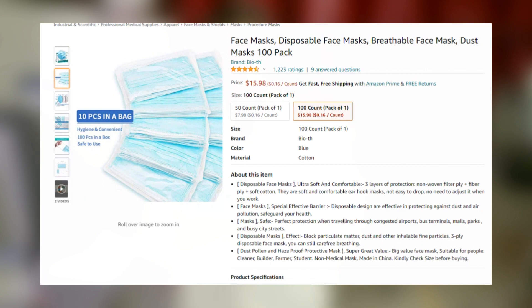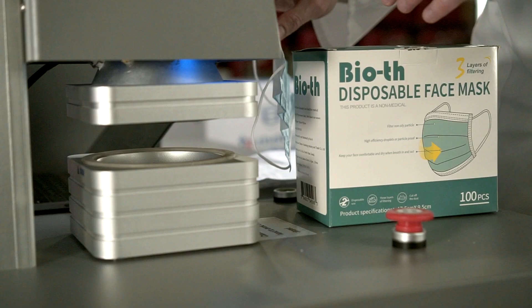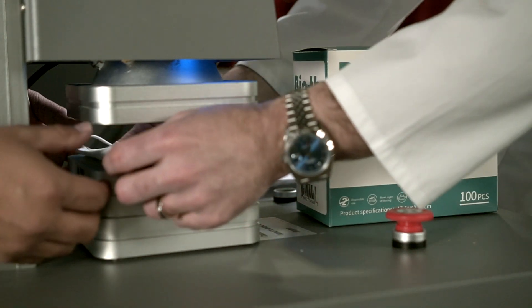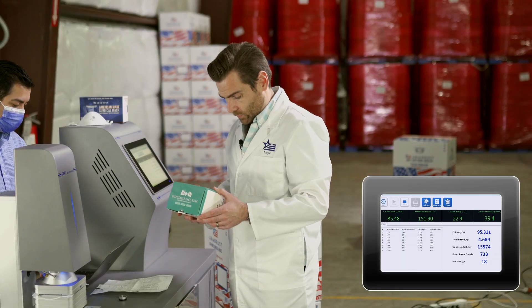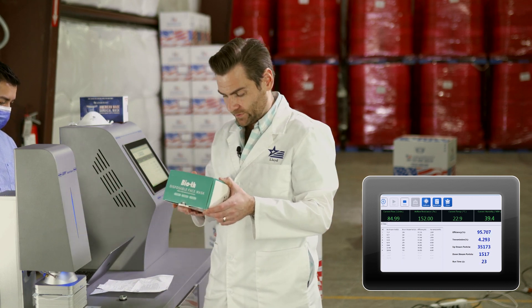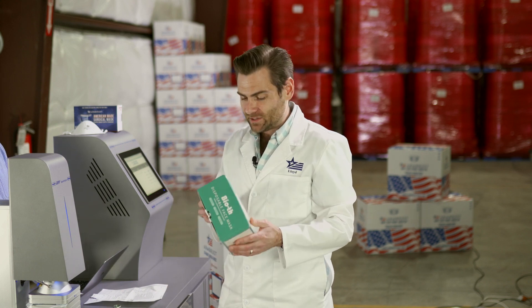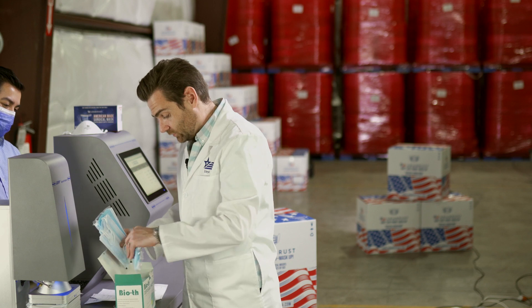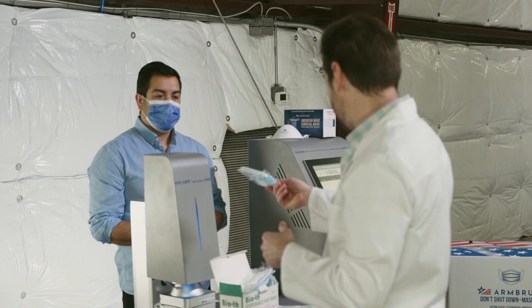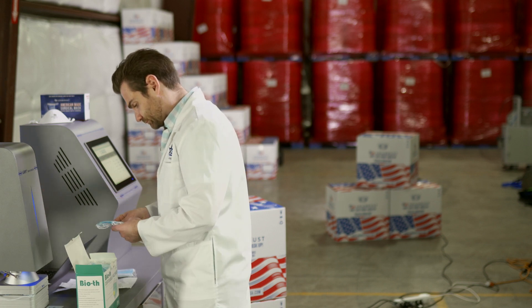It claims three layers of filtering, which is a bit misleading because two of those layers don't really filter. We make these masks, so let's see what Bioth has in store. It's a Chinese-made mask, which is where most masks are made, and they're individually packaged in packs of 10 — I kind of like that; you can put them in your purse, fanny pack, whatever.